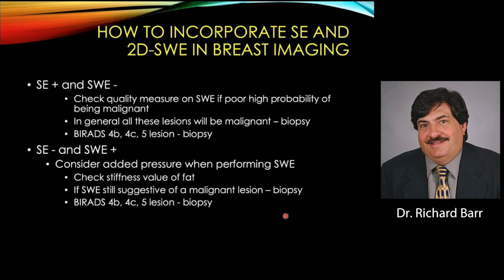If the strain is negative and the Shearwave is positive, which I must say I rarely, if ever, see, check to make sure you didn't add pressure, precompression, when you're doing the Shearwave. You can also check the stiffness value of fat. It should be about 1.2 or 1.3 meters per second. If it's much higher, repeat your measurement with less pressure on the breast. If it's still positive and suggestive of a malignant lesion, obviously we would do a biopsy.